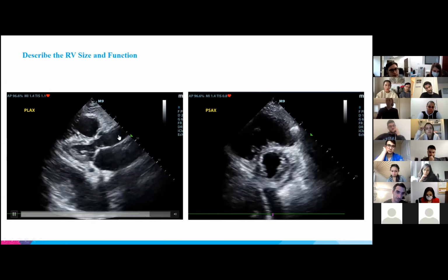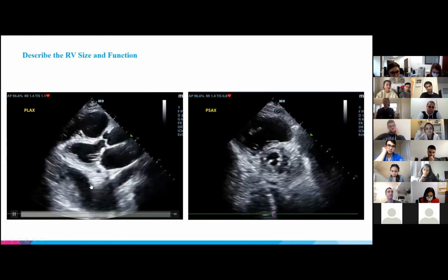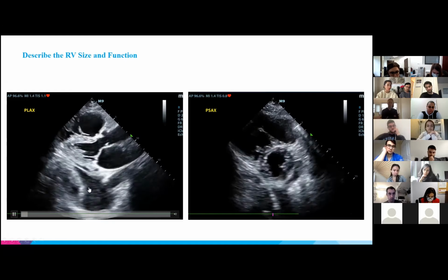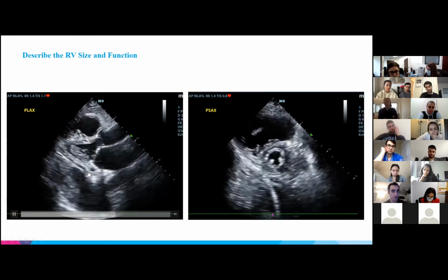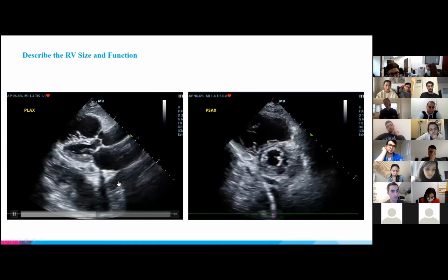So I would say this patient, it's kind of a trick question. I think that this patient actually has both. If you see black below the heart, you always want to know, is this pleural or pericardial? So we use the descending aorta as a marker. You have to imagine it, but I think the descending aorta is down here.